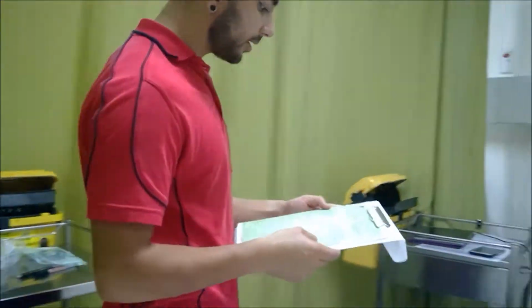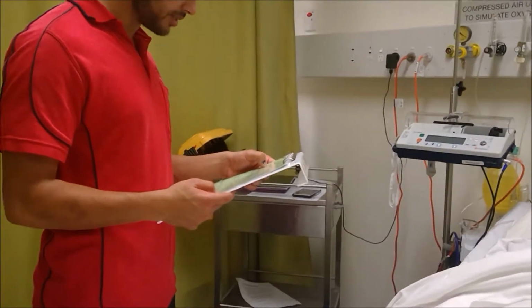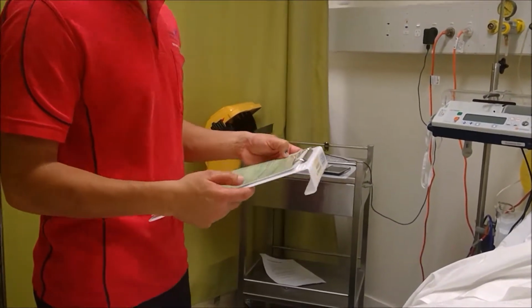Okay, we have a PCA order. It's signed by the doctor. Morphine for post-fractured ribs. Okay, let's introduce ourselves.